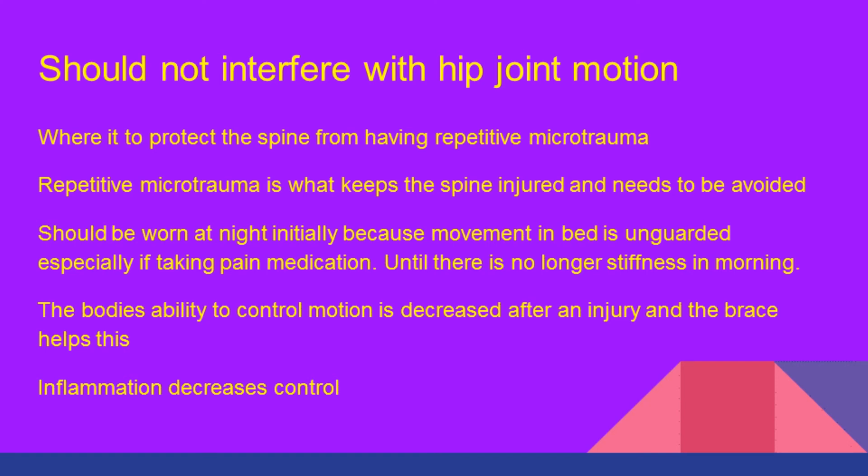But when we are injured, our body's ability to control is decreased. And as we get better and heal, we get more and more of that, and we'll need less of this stabilization belt in the future.